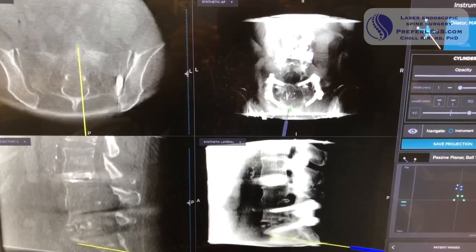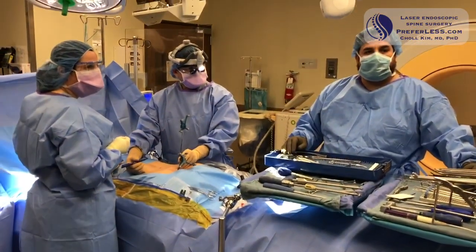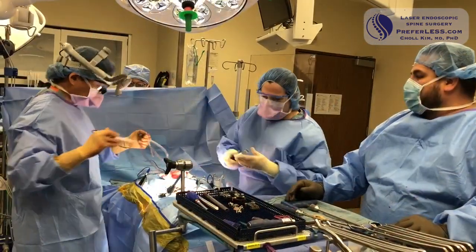No, but it's right in my way. Could also do an S2 screw. We'll see. Hopefully I won't even have to do that. You've got plenty of room, maybe an S2 would probably work.